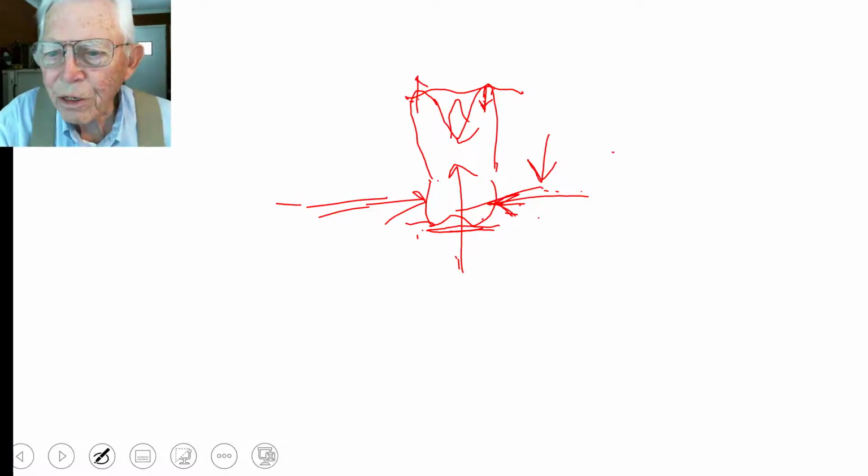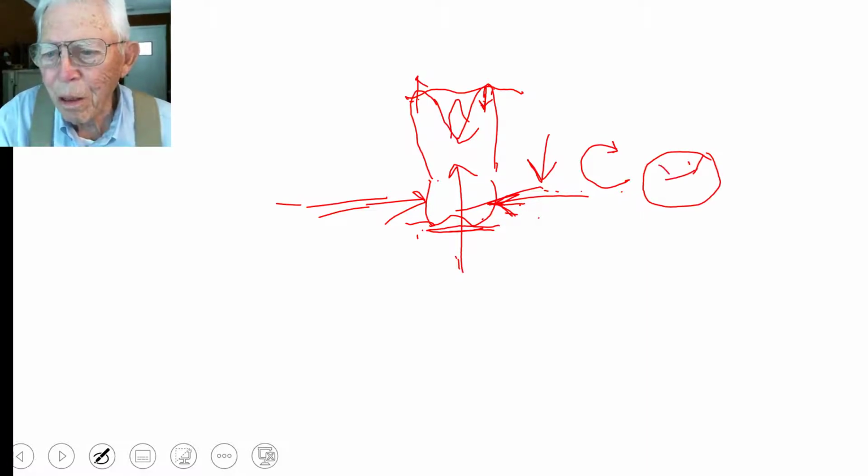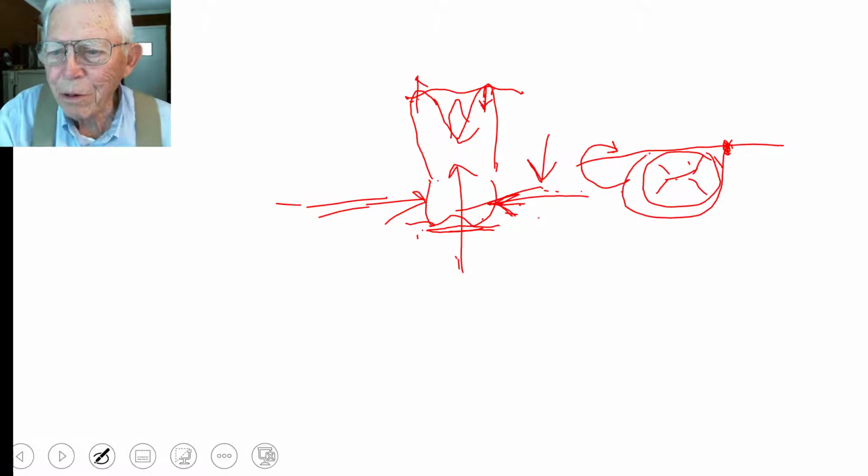Or if I just take a tooth and want to twist it, like I'm looking down on this, say there's a bicuspid, something in here, and we're going to try to spin it. We're going to put something on here, that chain elastic, wrap it around the tooth and come over here, and I turn the tooth in this direction.